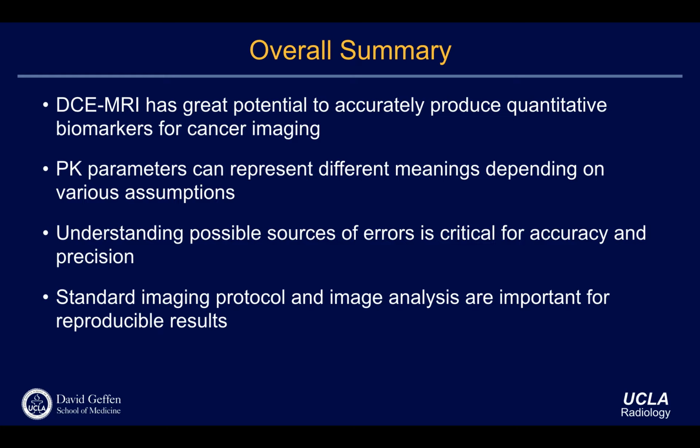Okay, so standard imaging protocols and image analysis are important. Particularly, people are very interested in using MRI as a measurement device. Initially MRI was developed as an imaging device, right? Just showing a nice image quality was good enough. But now people are looking into more functional information, more quantitative imaging, and a lot of faculty members in our department are also very interested in quantitative imaging biomarkers.